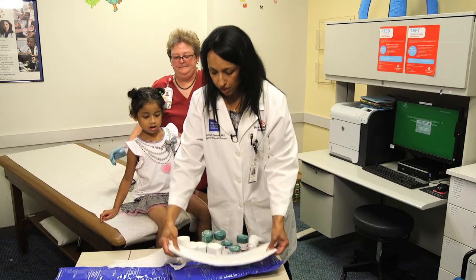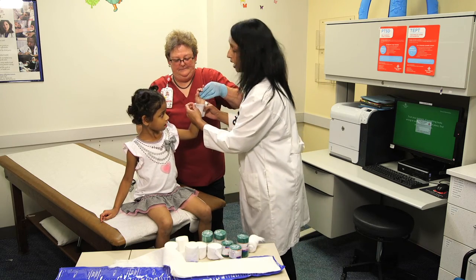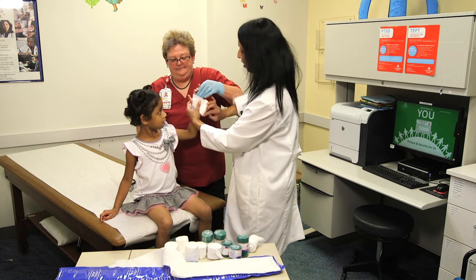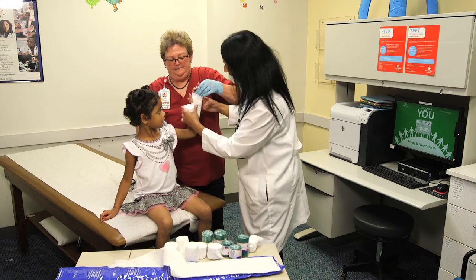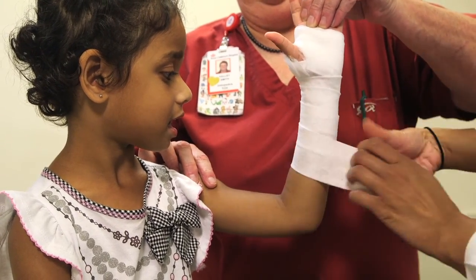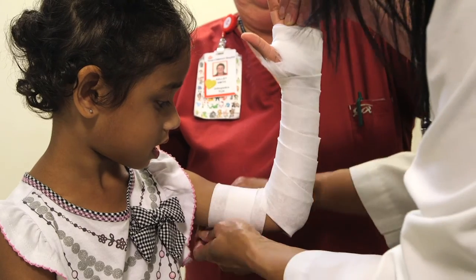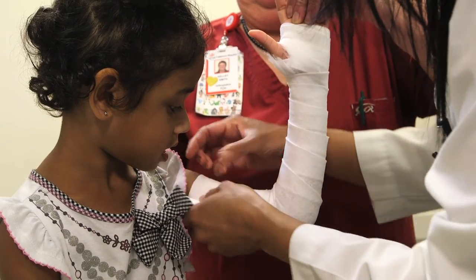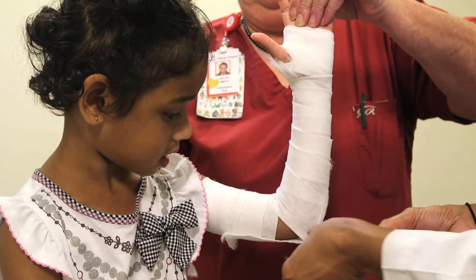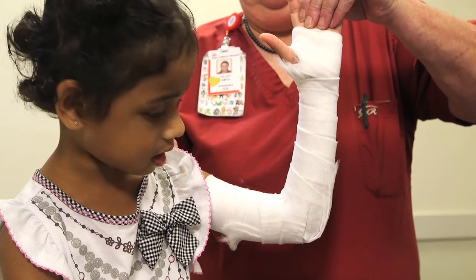Once you have the material cut, you're going to begin wrapping the patient with the soft web roll to give them a nice padding underneath. Start from above the wrist and tear the material as you go around to get a nice conforming fit. When you wrap the material, you want it to have a nice, intimate fit with no wrinkles. In areas where there's a bony prominence, you want to be sure and put extra padding in that area.